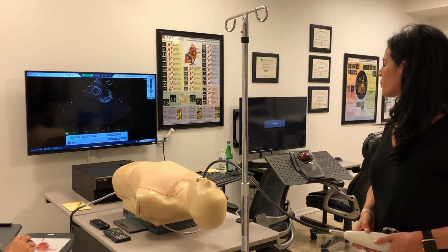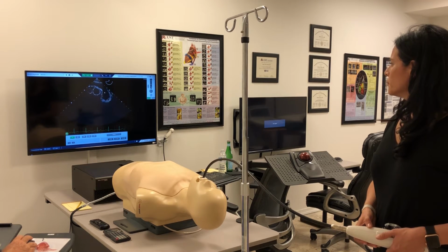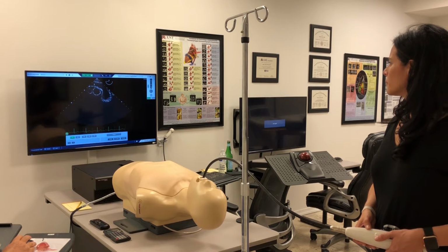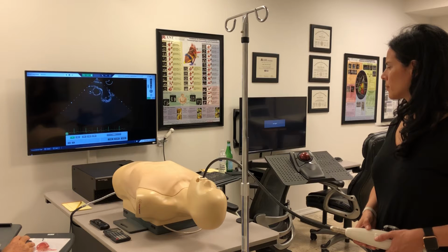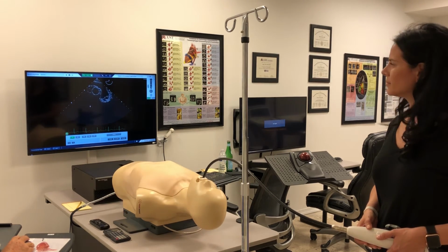Good. So here is the ascending aorta in short axis. Here's the main pulmonary artery, and this is the RPA. You can tell it's the RPA because it ducts between the probe and the superior vena cava. So it's got to be the right pulmonary artery because of its proximity to the superior vena cava. Good.